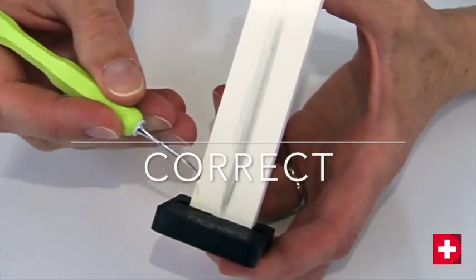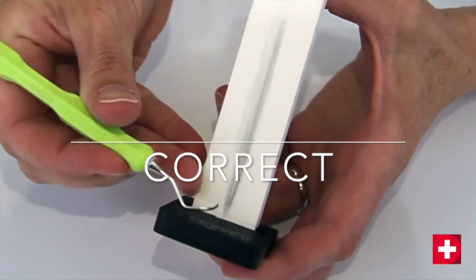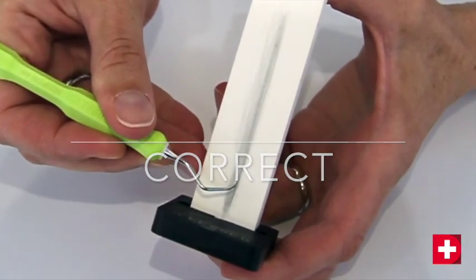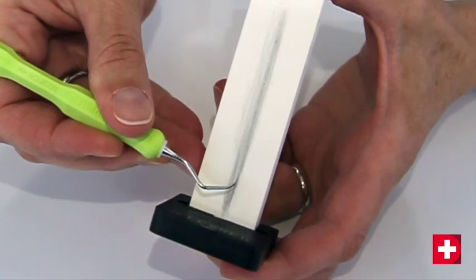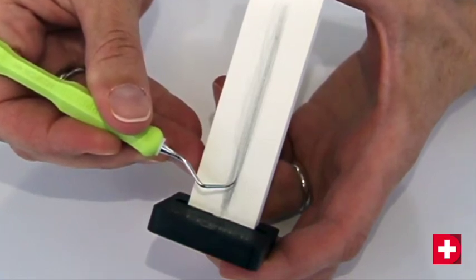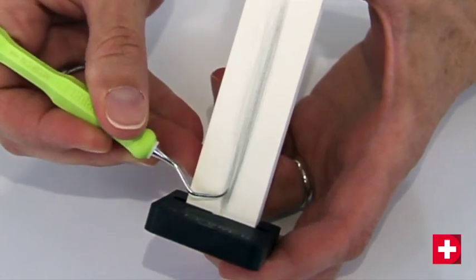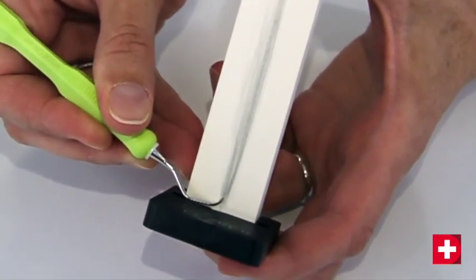The instrument is correctly positioned when the handle forms a right angle to the stone, resembling a T-shape when viewed from above. In addition, the blade is pointing towards the thumb, thus lying along the axis of the stone.